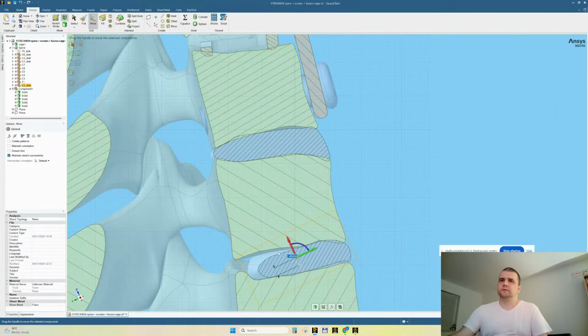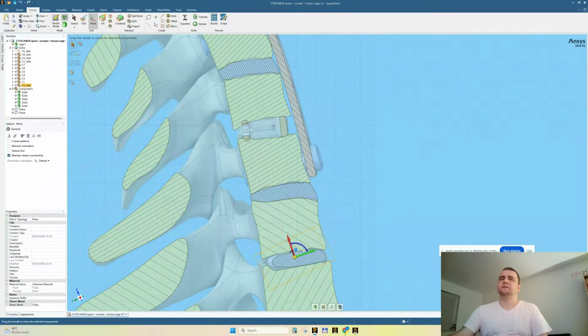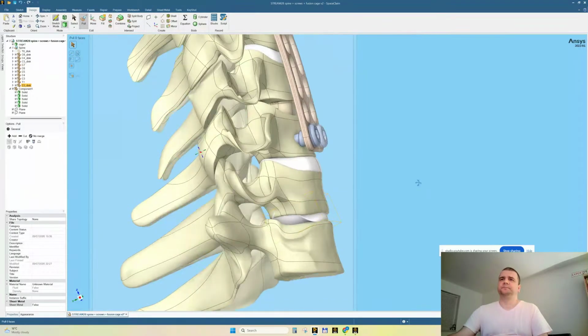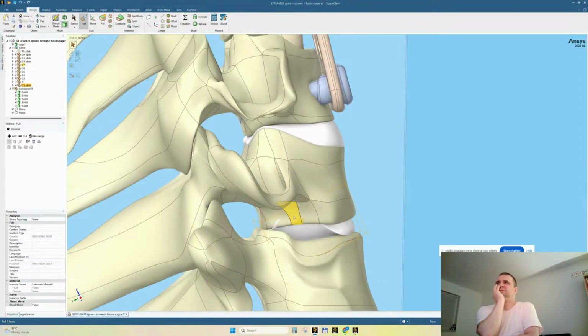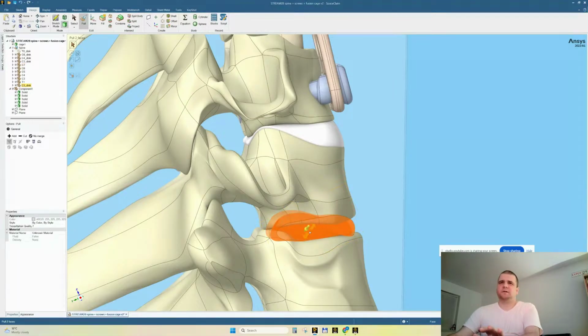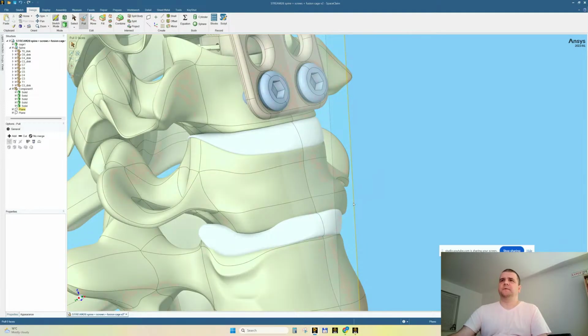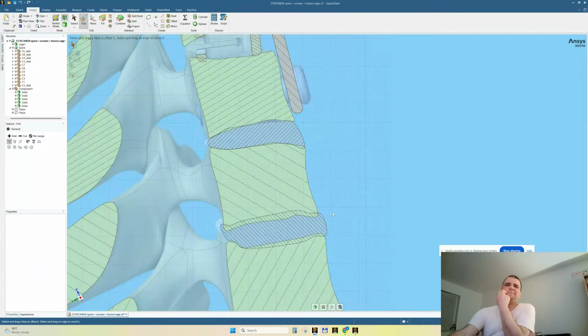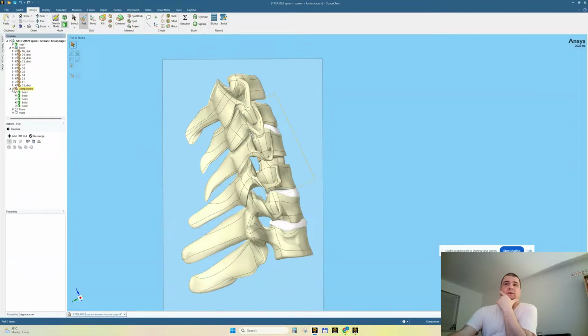Oh, it's so nice. Can I or should I rotate it? Something like this. And I think I need to scale it up a little, yes. But I like this. Sincerely, I like this. Let me scale it up a little. It looks pretty weird. It looks too weird for my taste. So what can I do here? Section mode. Okay, let's not complicate our lives.